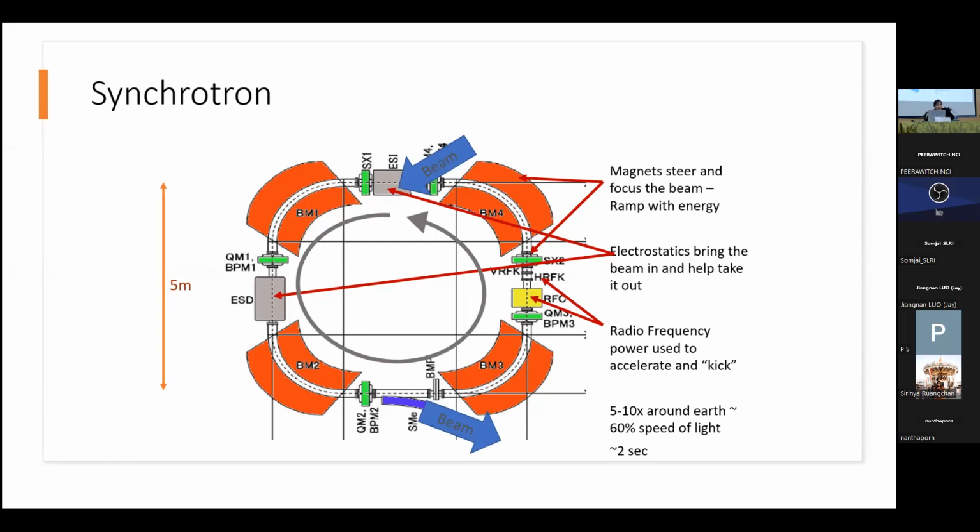Every part is very important, but understanding how the beam is extracted in the synchrotron matters. I'm spending a lot of time on synchrotrons because that seems to be initially the vendor we may go with, a synchrotron-based one, so it's good to understand these things. As the beam's extracted, I'll spend a little bit of time here for those more on the accelerator physics side, since we're at this center right now and not necessarily a medical physics center.